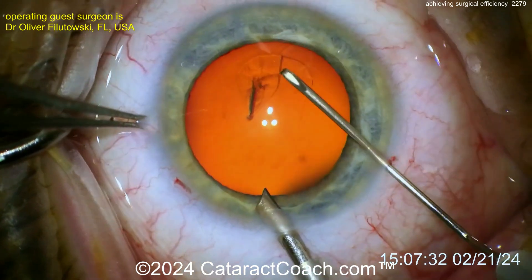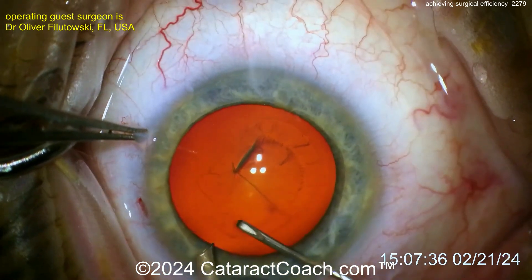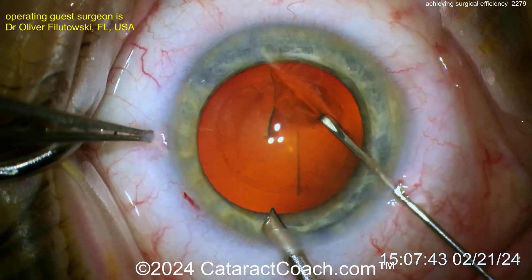Get the REXIS started with a cystotome. That's being done with a cystotome through a paracentesis only, no main incision, in order to keep the AC formed. If you had a big incision, look how much that thing flops around — you'd have more AC instability. That's why it's being done through a para.